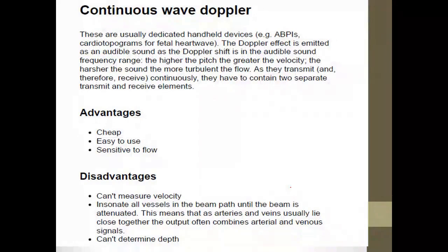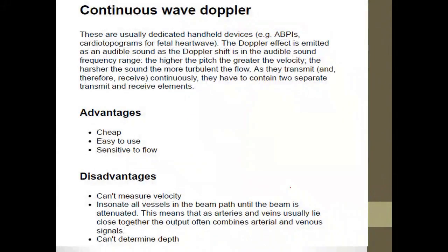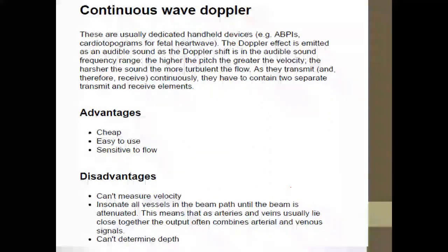Your eye's detection speed becomes lower, so the frequency your eye captures is less than the frequency of the fan's movement itself. The same idea applies, for instance, in cardiac imaging, where there is fast movement. The heart motion needs a technique that is fast enough to detect it without creating an aliasing artifact. As we mentioned before, data can be mixed or lost in the reception. So how do you work on this? You use continuous wave Doppler.